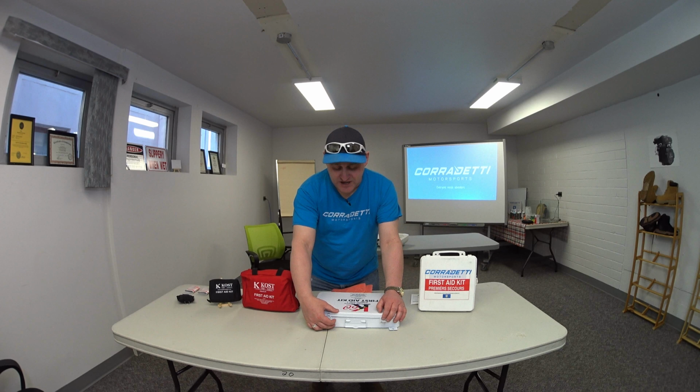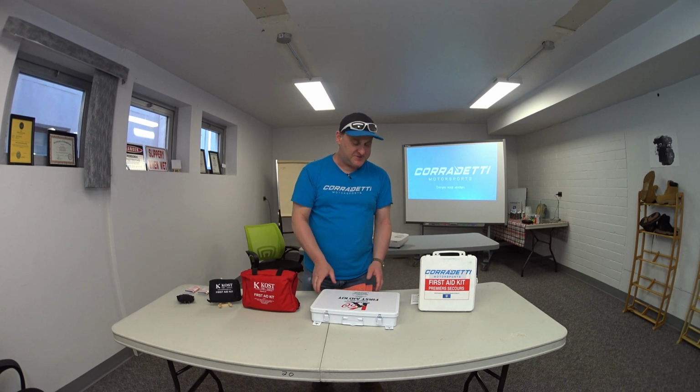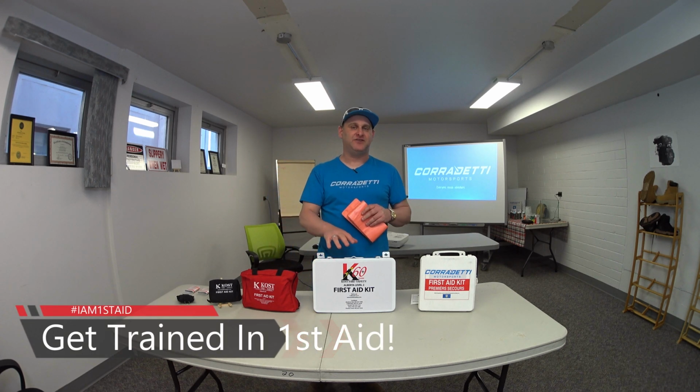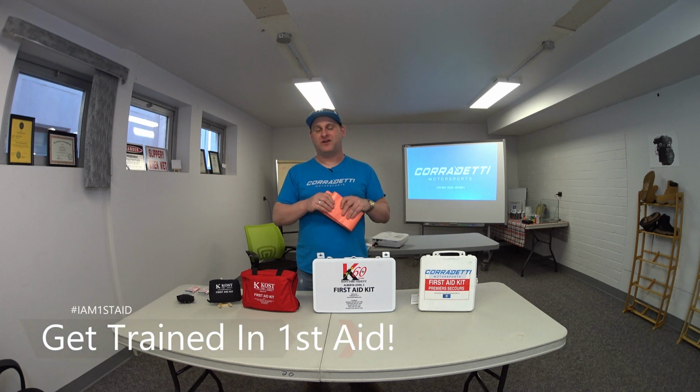This first aid kit also, if it's talking CSA standards, what you're going to start to notice in the new protocols and what they're going to carry in content is some SAM splints. So they're going to offer a little bit more in terms of splinting options inside a CSA standard, along with glucose pills and now a tourniquet, which has been reintroduced as part of our first aid protocols. They're not putting any medications in here due to expiry dates, training, and other higher risk scenarios that the manufacturers don't do. However, we are going to cover what medications, once you're trained, you can consider to add to your kit.